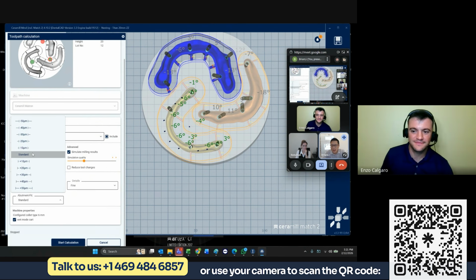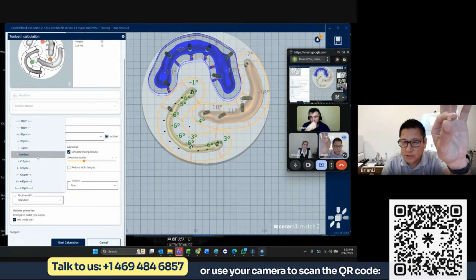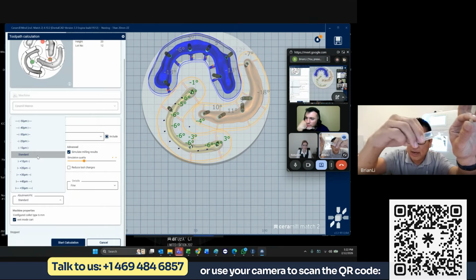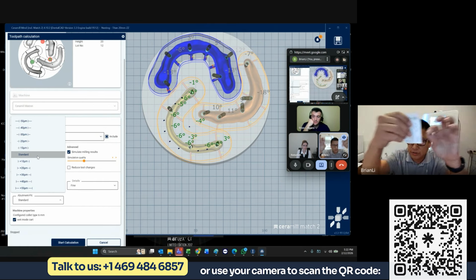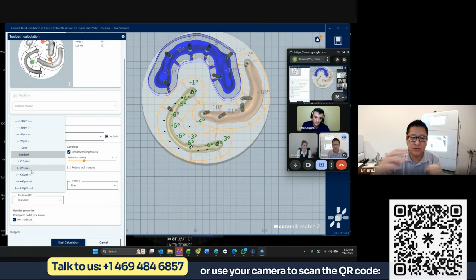So yeah. Abutment fit. This is also a very nice feature that we have in our CAM software that I've heard doesn't exist in others. If you are going to mill a screw retain crown like this, and you're going to buy a tie base and cement your crown to the tie base, this is an additional die spacer setting that you can adjust if you want to make them tighter or looser, totally separate from the implant libraries that you're getting from the companies. So this is a nice thing where you can make it tighter or looser to fit onto the tie base.